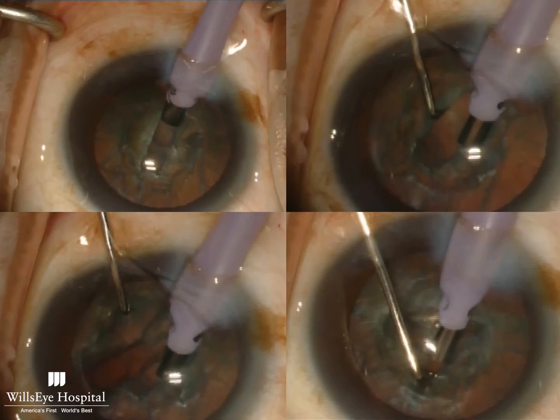So these are screenshots of divide and conquer technique. You can see here I'm creating a central groove in the lens, and then I'm starting to spread the nucleus here, continuing to spread. Here's a cleavage plane forming posteriorly, and then I've rotated it 90 degrees. Here's the original groove. Here's the new groove.